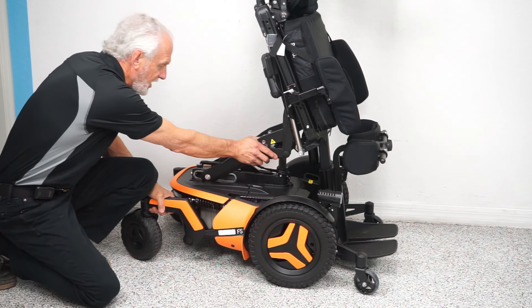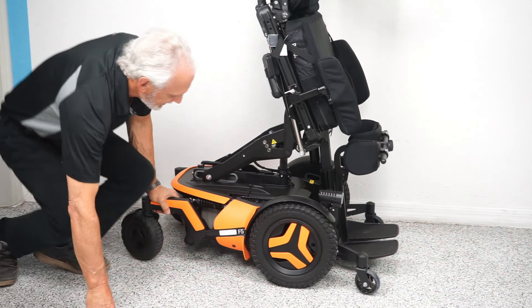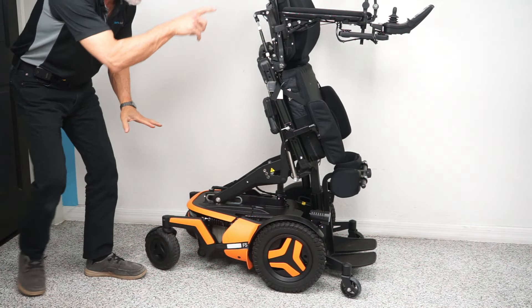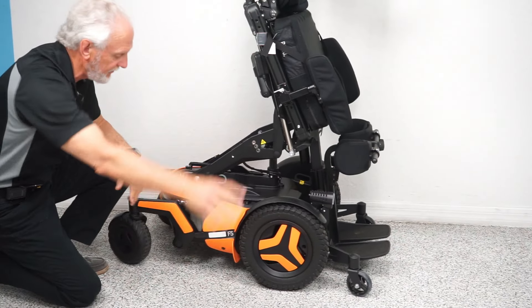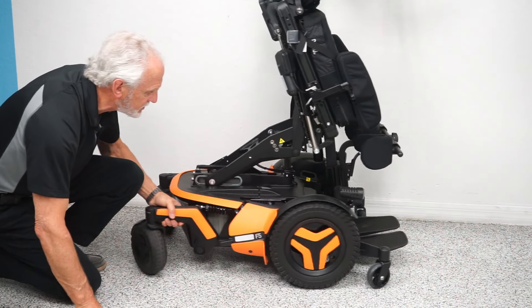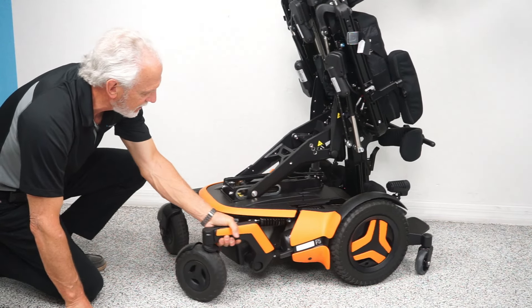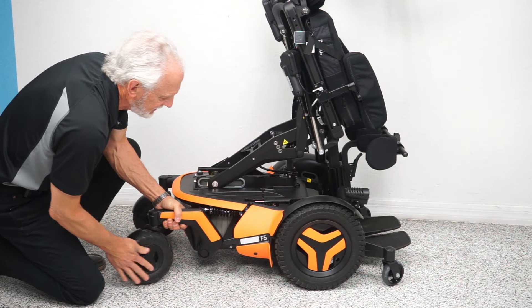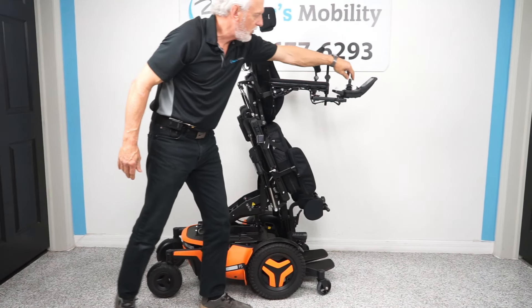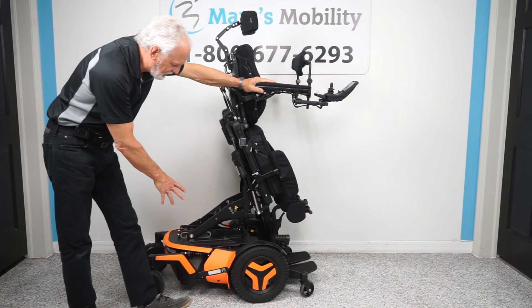If you wanted to push this chair manually, it weighs 450 pounds and it's in gear — it's not going anywhere. First, turn the power off, because if you leave the power on you'll have resistance in the motor. With power off, on the motor there's a little handle — push it down and your wheel is free. You've got to do both motors on both sides. Now you're in free wheel. As soon as you put it back in gear, the wheel locks, then turn your power back on and you're ready to go.